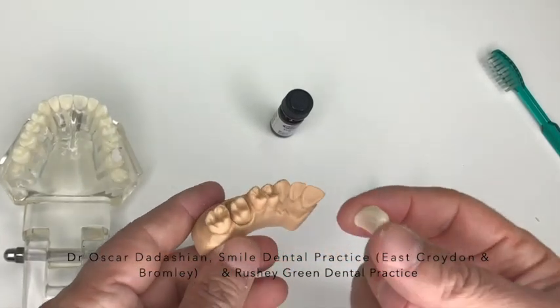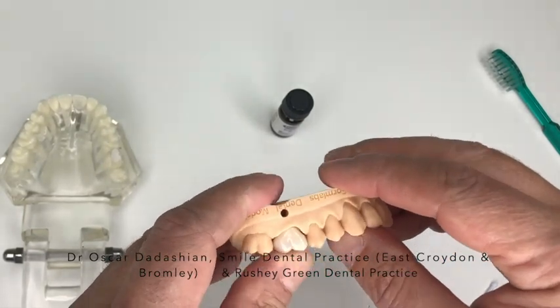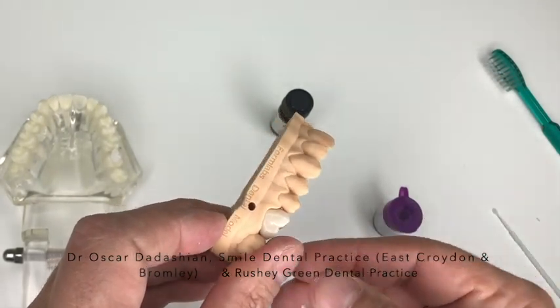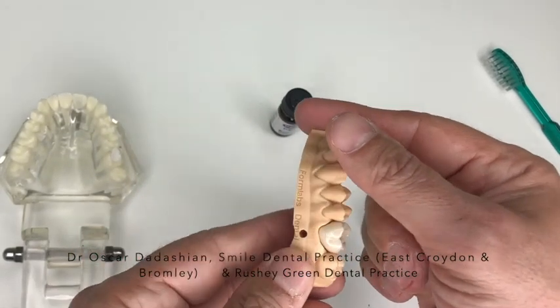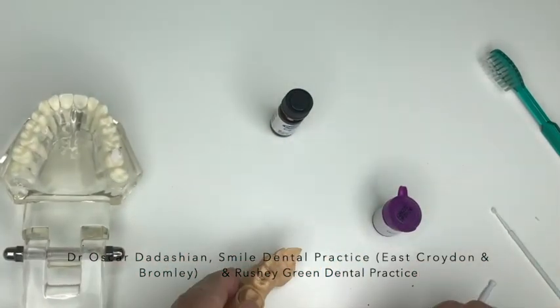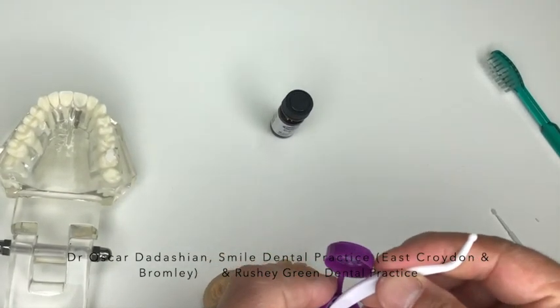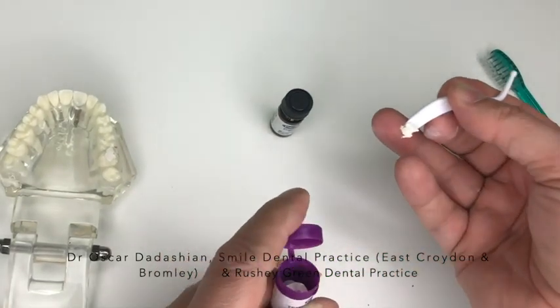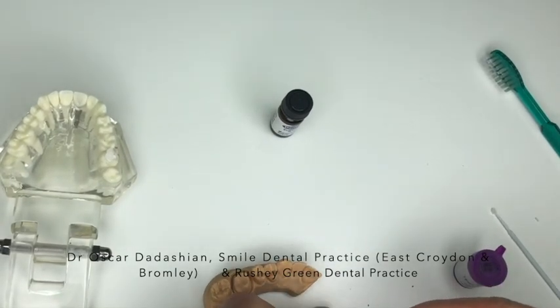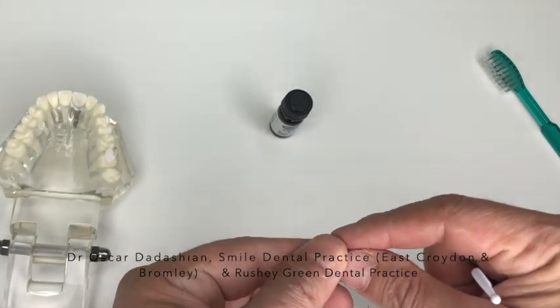We want clean surfaces. You then try your crown in first without anything. You try it in, make sure it goes in, make sure it feels nice and snug. You bite together and make sure that feels comfortable. Only then you're ready to fit your crown back in again. So the way you do it is that you take again a piece of this temporary. You don't need to use that liquid anymore. On the tooth itself, it will just make the tooth a little bit more comfortable, but you don't need to. I'm just making a little bowl or maybe a rice grain out of this.